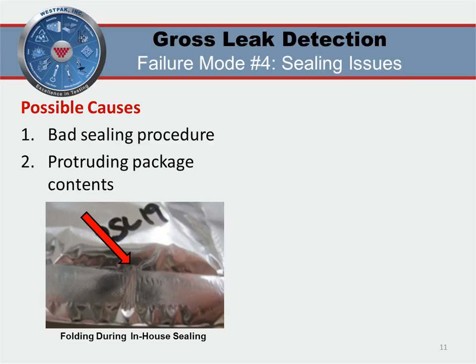Another possible cause can result from the contents inside your pouch or tray. For example, the contents might be slightly protruding, which could restrict proper sealing of the package.